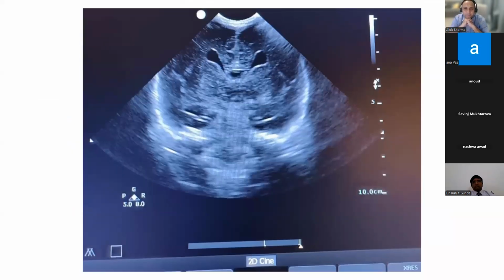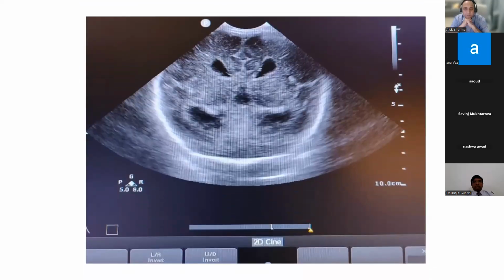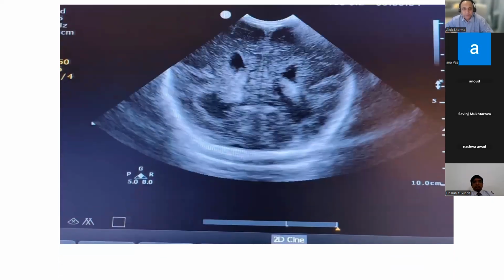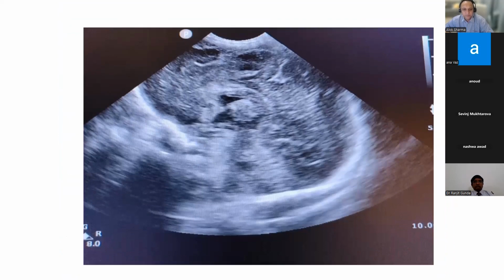So this is the coronal view. As shown here, the ventricle is dilated, the lateral ventricle. Yep. Here and the third ventricle also dilated. Here I wasn't able to see the corpus callosum. Well done. Yeah, and it is more posteriorly. Here is the midline, the mid sagittal.